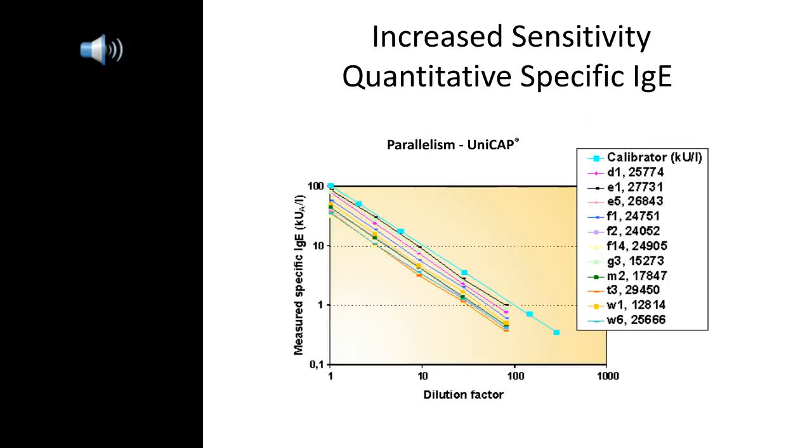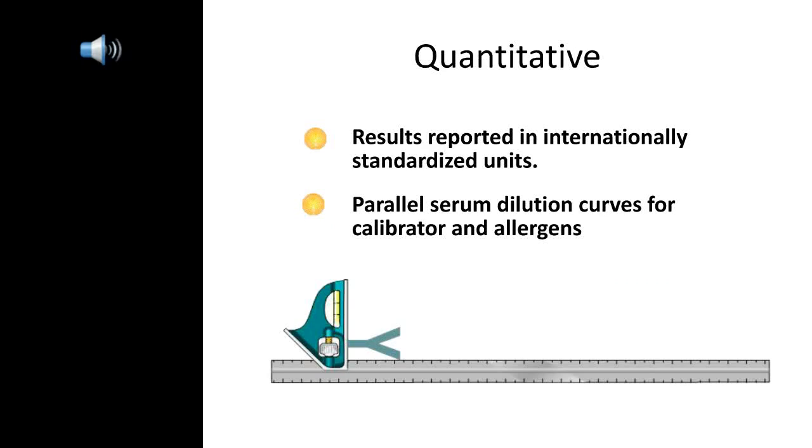And it was claimed, and I think there was some evidence, that there was enough IgE sucked up that in comparison with the total IgE, you could do parallel curves. And this led to the importance thing. A number of the manufacturers have done the same thing in terms of converting a qualitative test to a quantitative test.